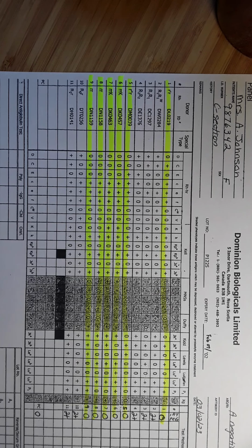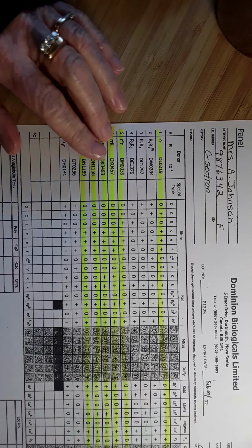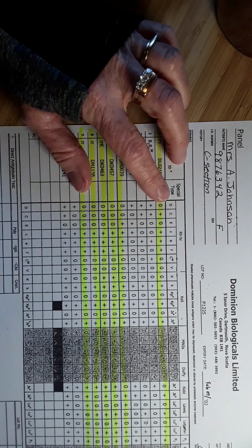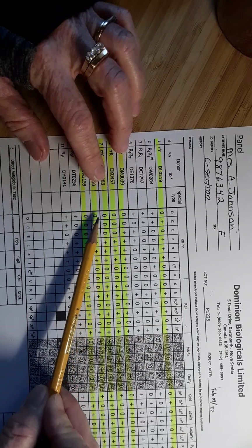So we're going to go down each column and we're going to start at D. So I'm just going to move my paper over a little bit. Looking down the D column, I'm going to see if I have any D positive cells that did not react with the patient's plasma. So I only need to look at the highlighted rows, right?